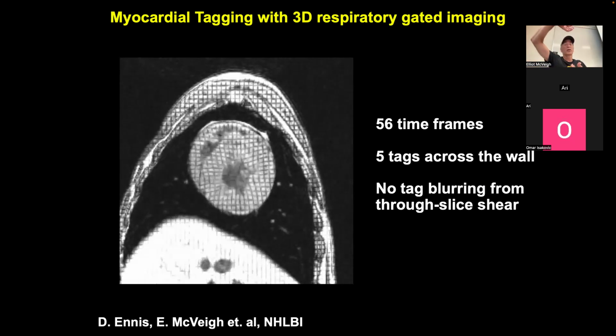You then put a phase shift across that field of view with one gradient, and then you hit it with another RF pulse, and then depending on the phase of the magnetization in the plane, the RF pulse will take the magnetization to minus Z, and then when you go to image, you just won't get signal, right? So that's sort of how it's done. Okay. There's more complex, you can make all kinds of patterns, right? But it's RF excitation with gradients.